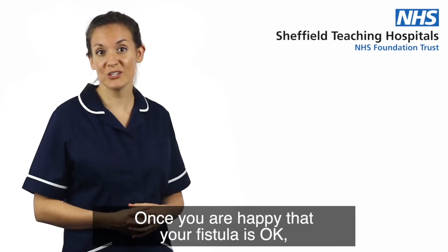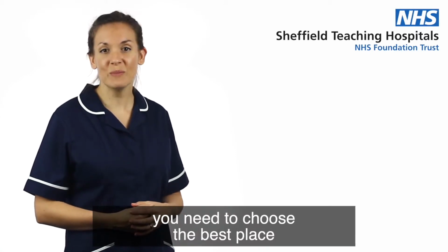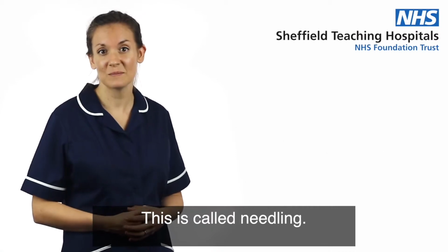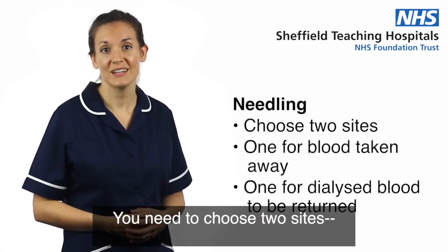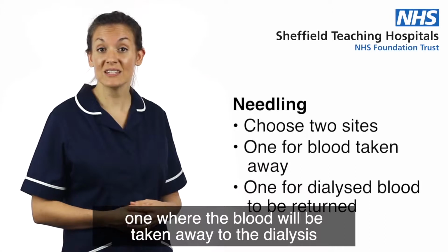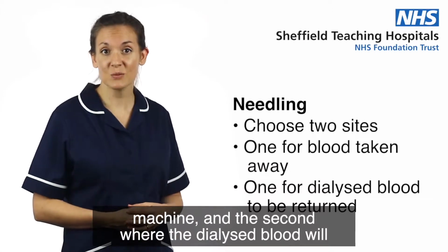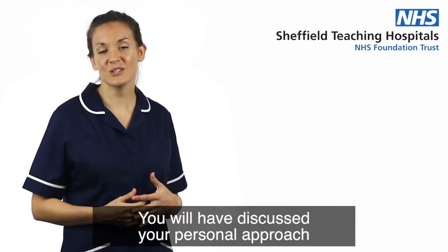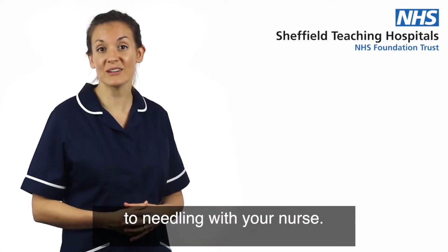Once you're happy that your fistula is okay, you need to choose the best place to insert the dialysis needles. This is called needling. You need to choose two sites, one where the blood will be taken away to the dialysis machine, and the second where the dialysed blood will be returned. You will have discussed your personal approach to needling with your nurse.